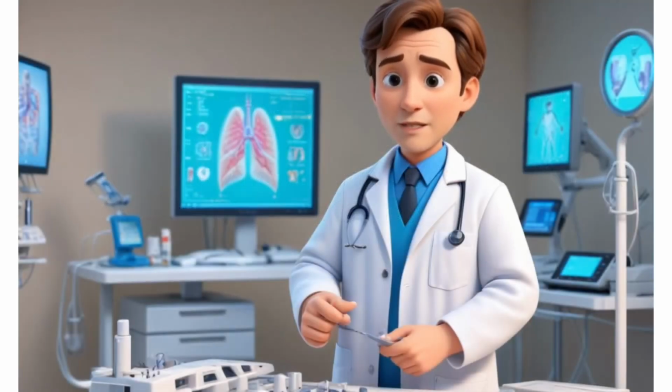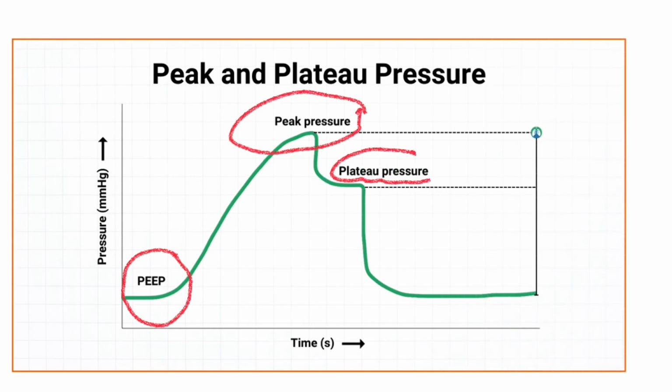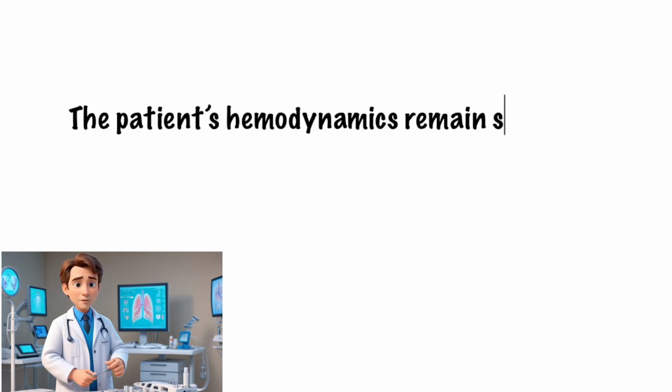Driving pressure is defined as the distending pressure above the applied positive end expiratory pressure, PEEP, required to generate tidal volume. The patient's hemodynamics remain stable throughout the titration.